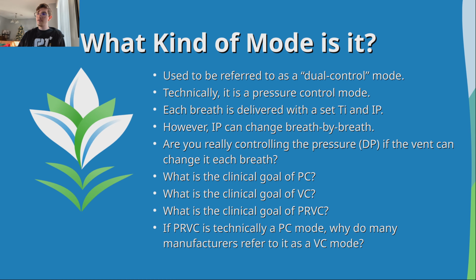What is the clinical goal of pressure control? As in, I have a patient, they are intubated, they are here for this problem. You want to put them on pressure control. Why? Well, first of all, it tends to be a little more comfortable. But second of all, you can control the driving pressure. You can control the plateau pressure. And the patient can take in whatever volume they want.